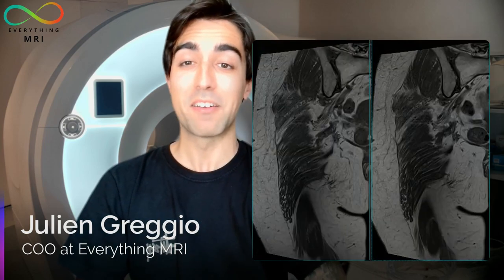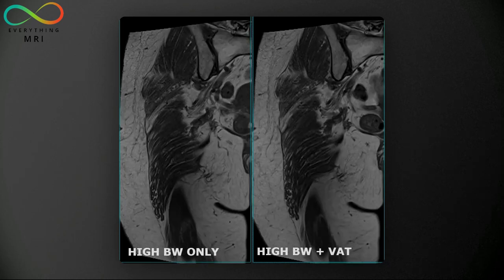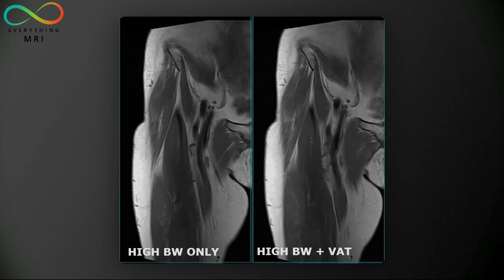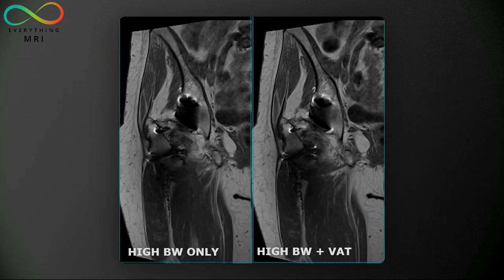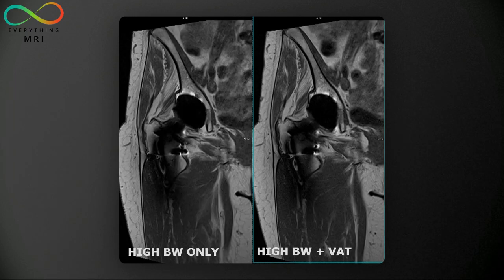Let's try to understand the real impact of VAT as regards metal artifact reduction. On the left side of the screen we have our coronal T1 acquired simply by increasing the receive bandwidth but without applying any further metal reduction technique. On the right side we have combined a high bandwidth with VAT specifically at around 80%. Spotting the differences straight away is a little more challenging at this stage. If we look closer, we can notice that the signal pile-up is slightly reduced when VAT has been used in conjunction with high bandwidth, but overall the impact of adding VAT is kind of negligible if you have already increased the received bandwidth significantly.